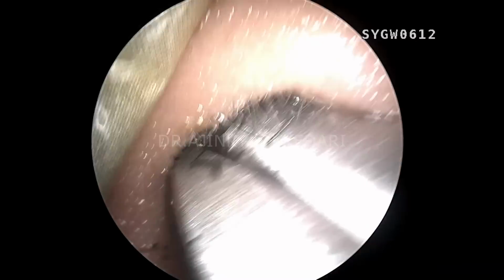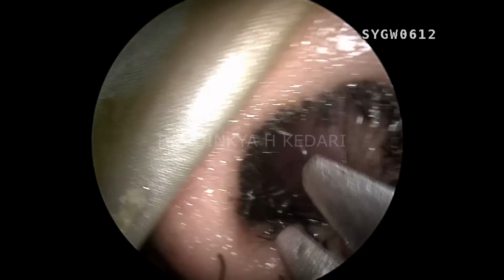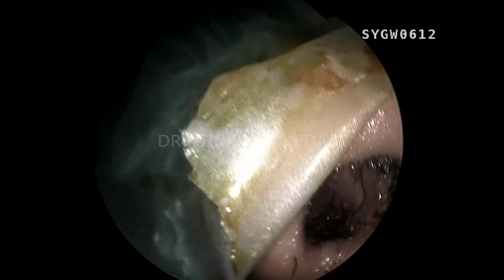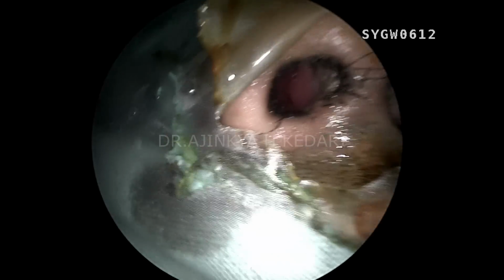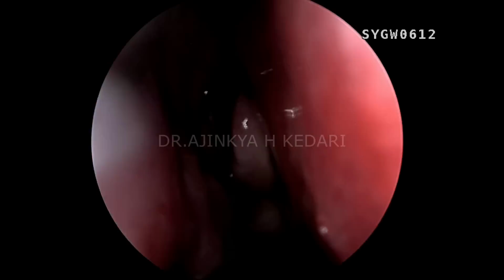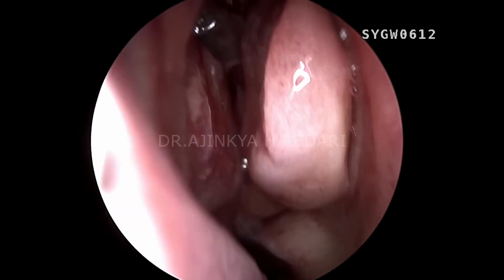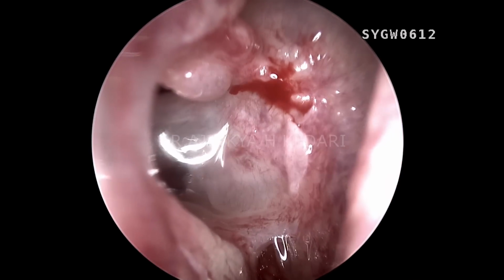So there's some kind of a clot, and what you can see me doing right now is taking out the nasal vibrissae, that's called nasal hair. Removing this hair is really important, otherwise it's going to keep fogging your lens. So I prefer to remove the nasal hair a few hours prior to the surgery.